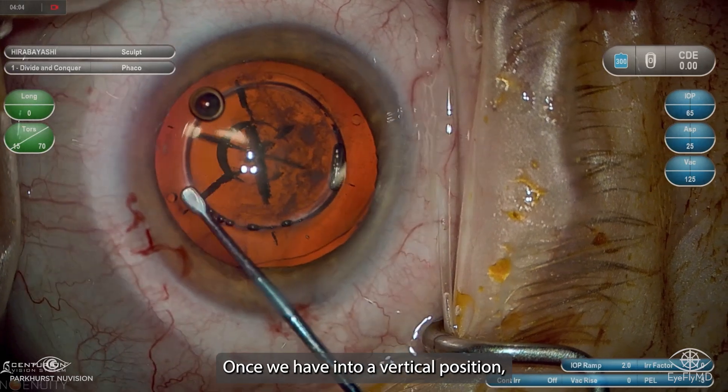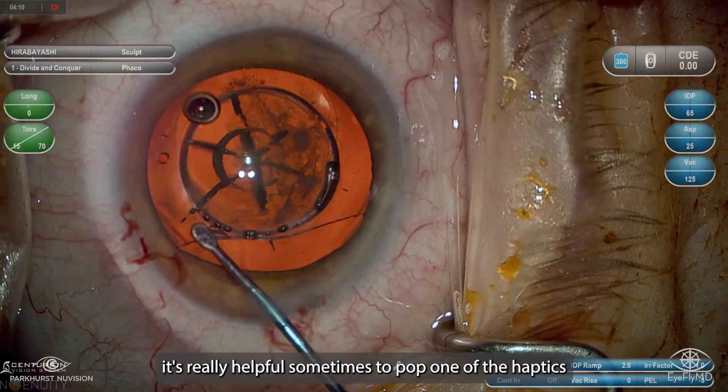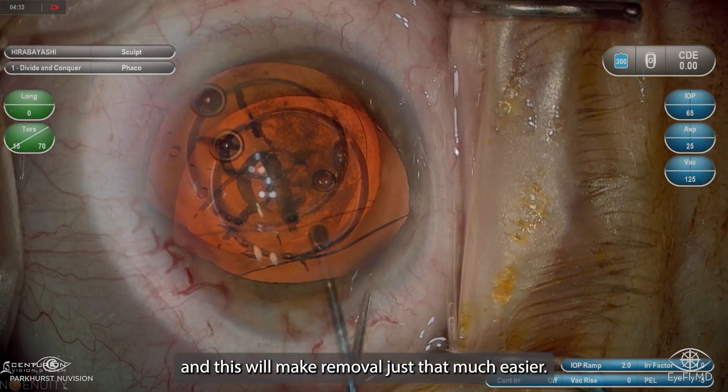And once we have it into a vertical position, it's really helpful sometimes to pop one of the haptics at least up in front of the iris, and this will make removal just that much easier.